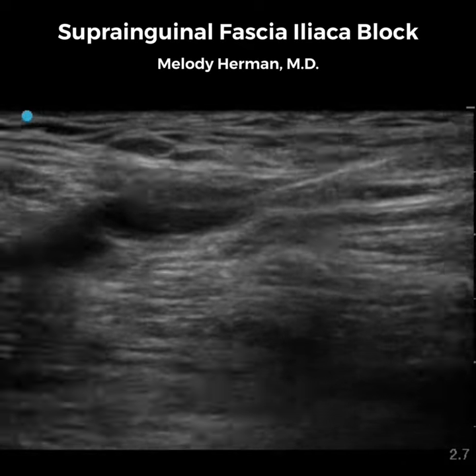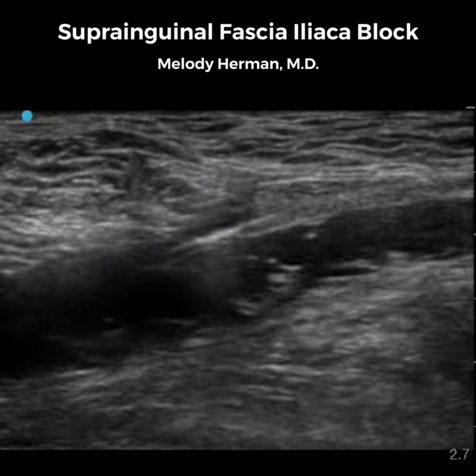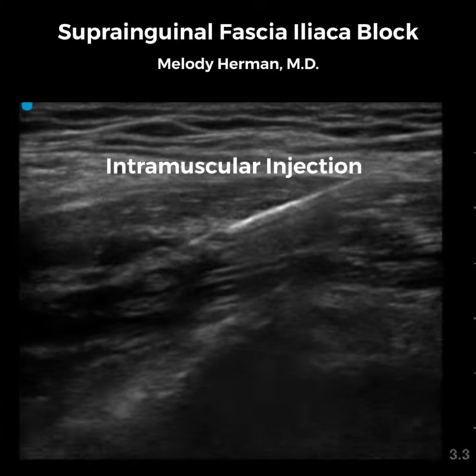As we continue to inject, notice that the puddle of local anesthetic expands and contracts. This indicates that we're in a true fascial plane. If we don't see this motion or the muscles start to look shreddy, it's likely that we have an intramuscular injection and our block won't work.